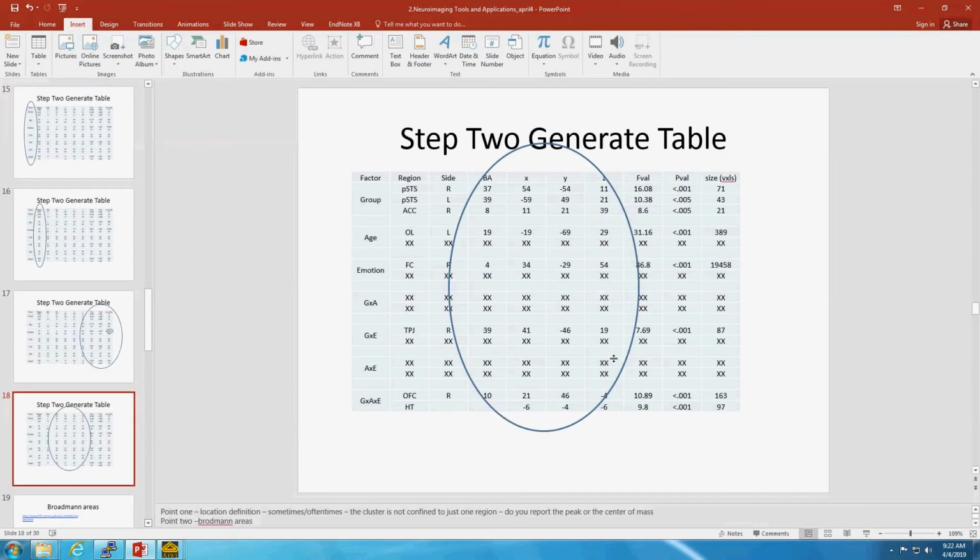The next thing is putting it into standard space. For each of these activations, it's in a normalized spatial grid framework, so there's an X, Y, Z coordinate for each voxel you have. That's something people always report: what is the X, Y, Z coordinate of the statistical effect that you have?